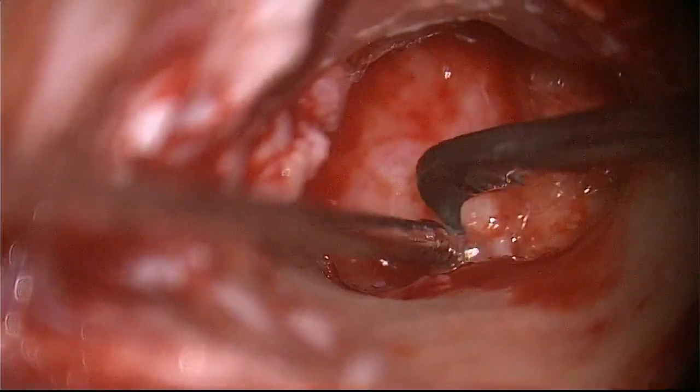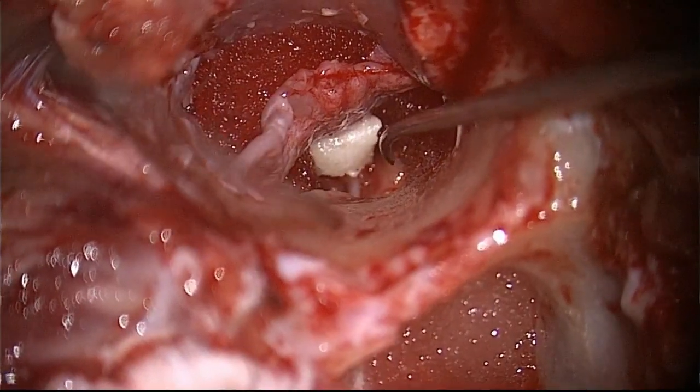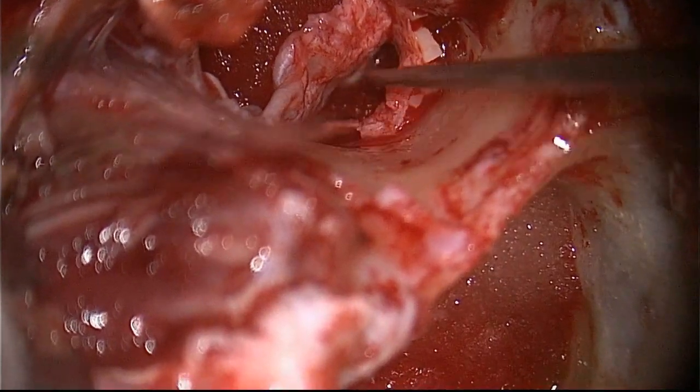This is an intact canal wall technique wherein the stapes is mobile and the long process was necrosed and there was cholesteatoma around it. It was removed, and now I used a malleus head to sit on the stapes by making a small facet on that, you can see.